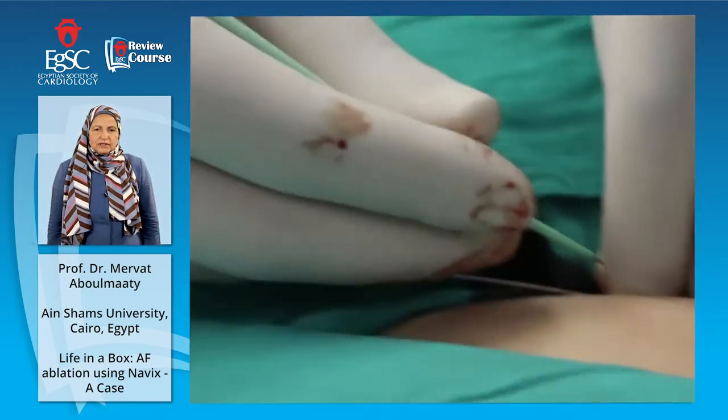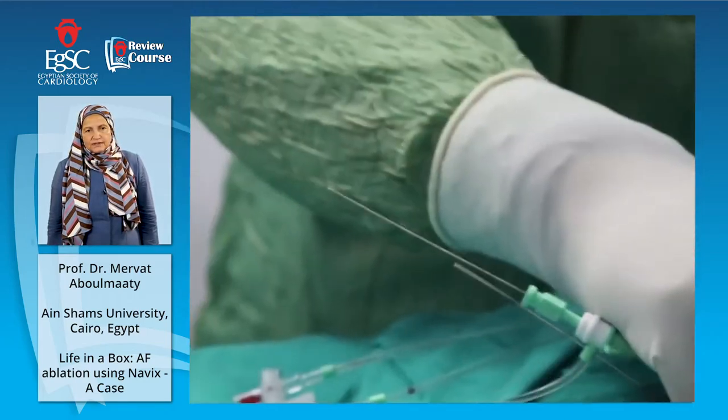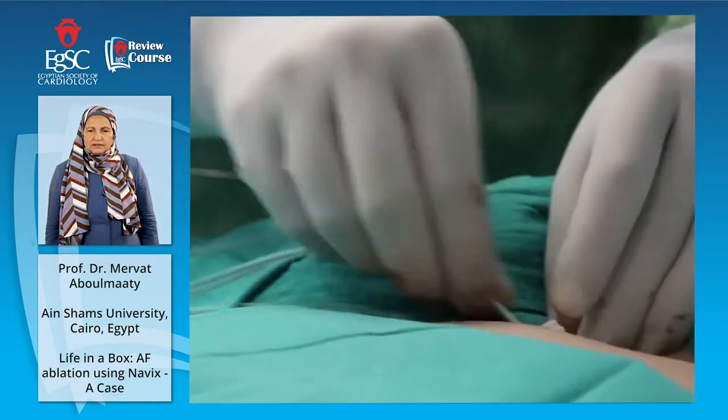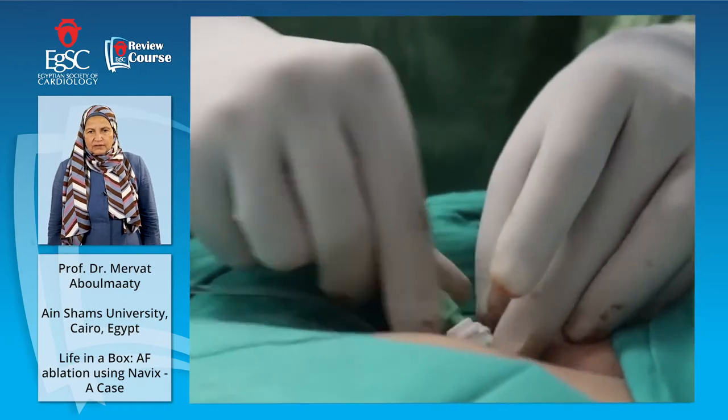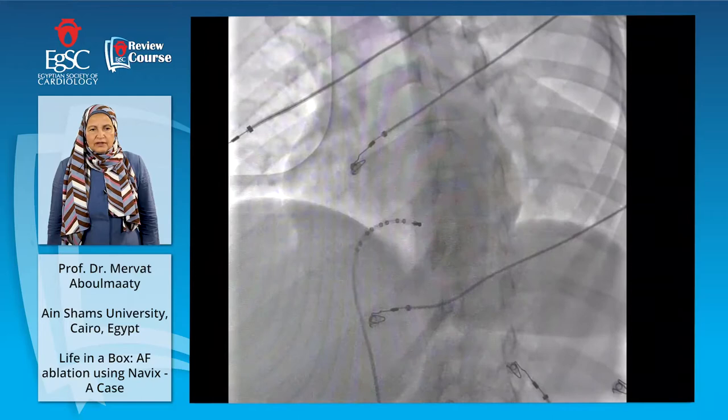This procedure is done under general anesthesia. Then he will insert 2-6 French sheaths. This is the green sheath. You know it, this 6 French. Quickly, yes. And another one, we'll take out everything and then we'll do good flushing.